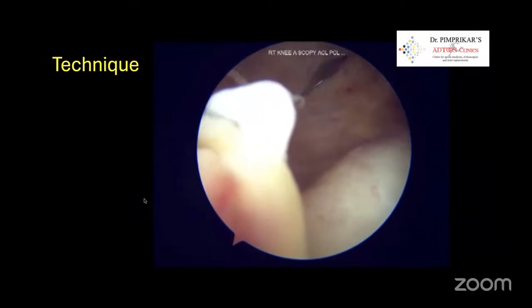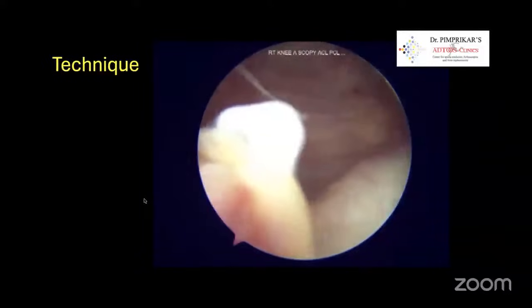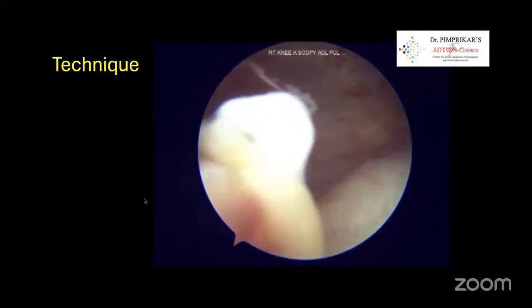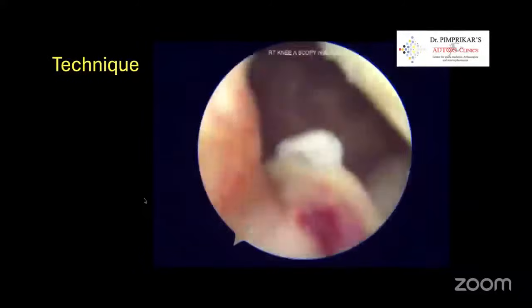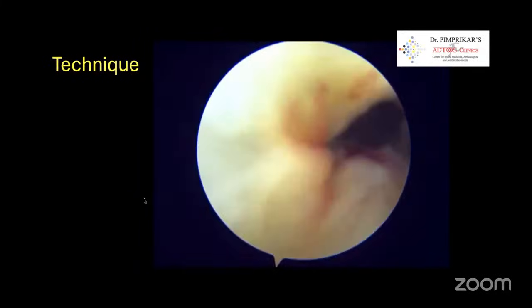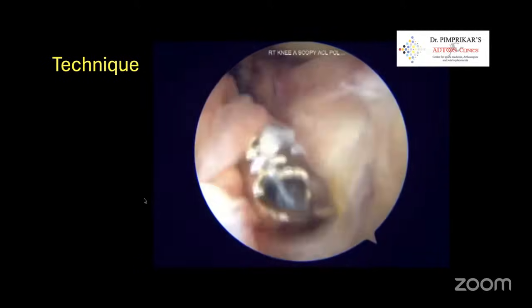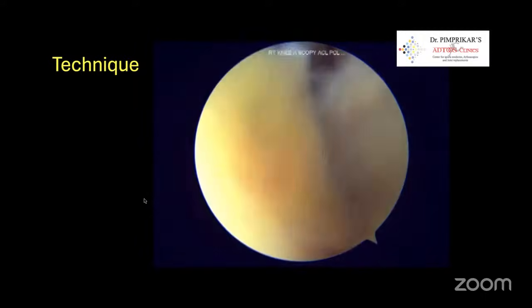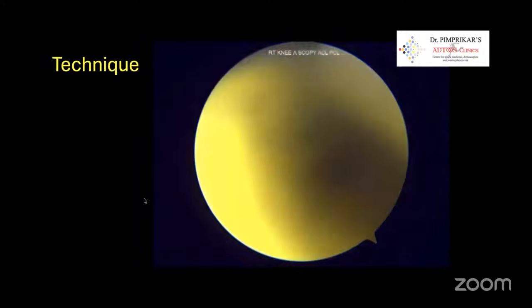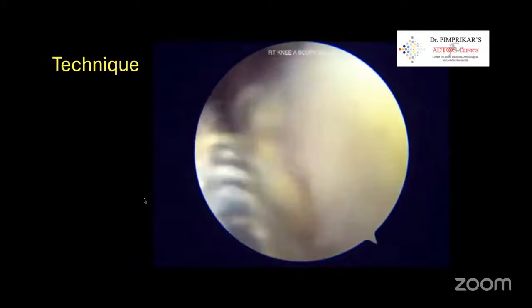I have entered the posteromedial compartment from between the medial femoral condyle and the PCL, and I have taken a posteromedial portal by inserting a needle onto the synovial fold and then creating a port with a number 11 blade. The port is dilated with a hemostat, and you pass a switching stick or a Wissinger rod which kisses the posterior aspect of the lateral femoral condyle and exits out of the lateral side, sparing, or far away from, the common peroneal nerve.